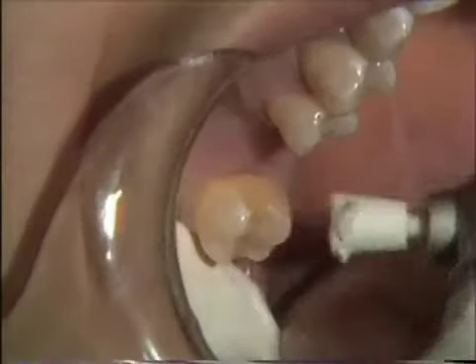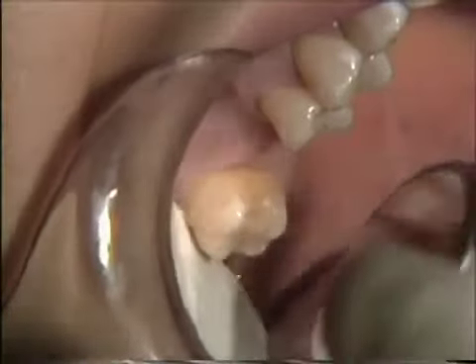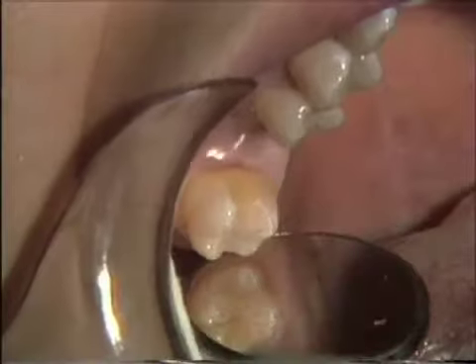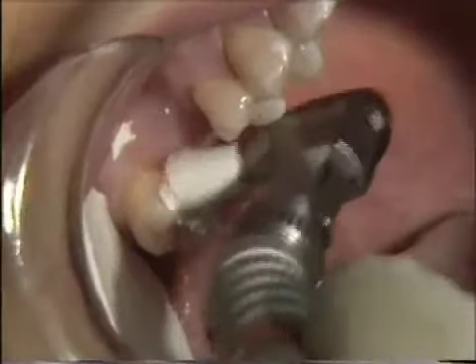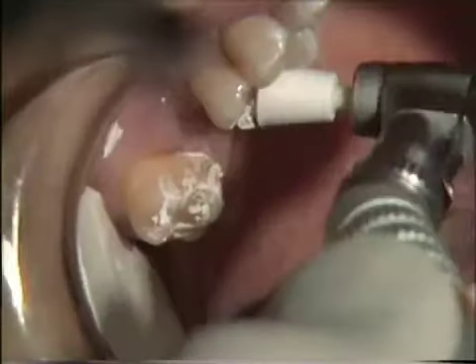The first step in cementation is to remove any plaque and material on these teeth. We will do a prophylaxis with a non-fluoride paste — this happens to be Xerocate. Since the tissue is up so high on the distal of this molar, we will not be able to put a rubber dam on because that clamp will impede the cementation of that distal arm. If you're not going to use a rubber dam, you have to be very, very careful not to get salivary contamination. So we are going to clean these areas and make sure the plaque is removed.